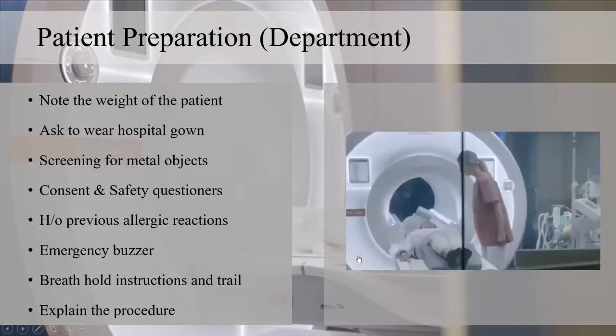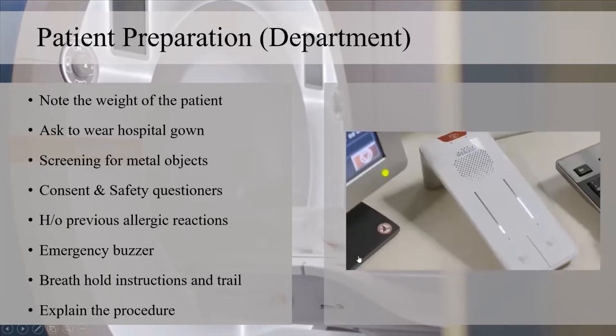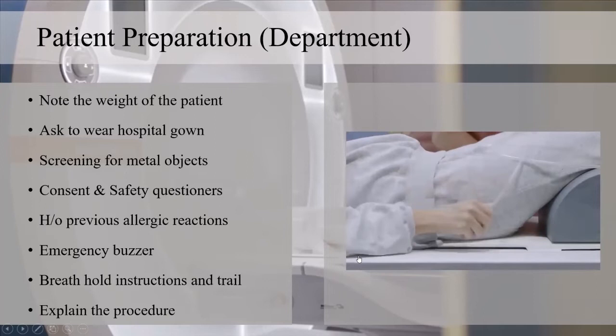Next, in case the patient wants to contact the radiographic technologist during the scan, for example if the patient is not feeling good, we can give an emergency squeeze ball to the patient. If the patient needs to contact the technologist, the patient can use the emergency switch.